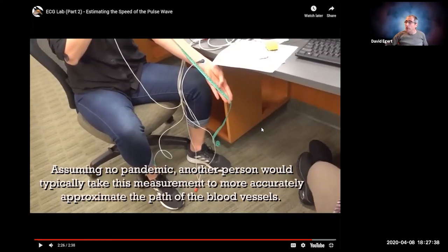Normally you'd be taking a much more accurate measurement of this, but I calculated what we're getting with this. You still get a perfectly fine value, so you can use the number that she comes up with. It works fine for getting a reasonable number.